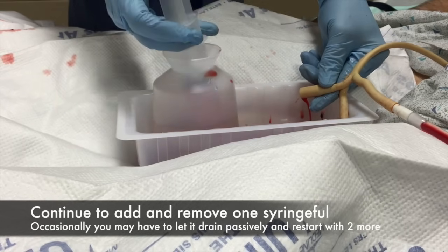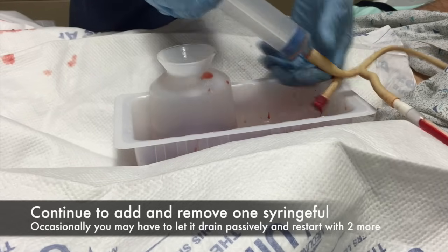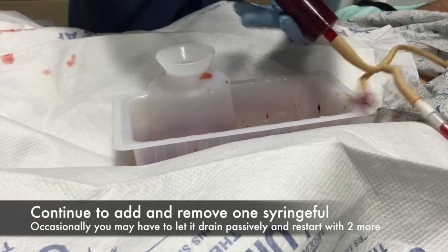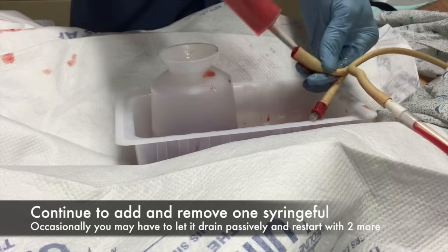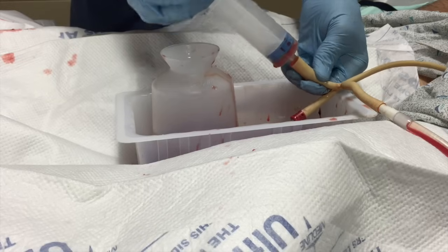Generally, we start with two syringes, just to be sure that we're not sucking against the bladder wall when we pull back. The patient probably has several hundred milliliters when they come in with retention and you put the catheter in, so occasionally we will let it passively drain between installations of fresh syringes of sterile water.